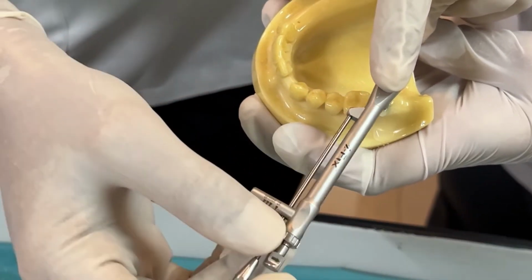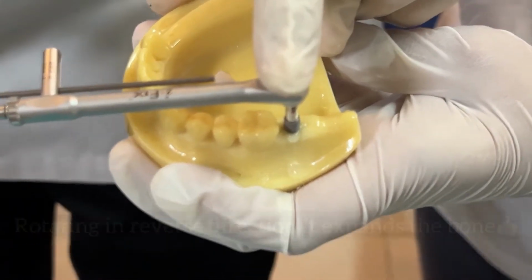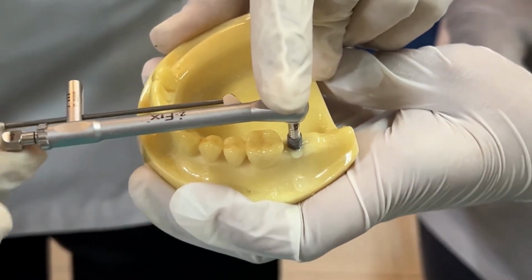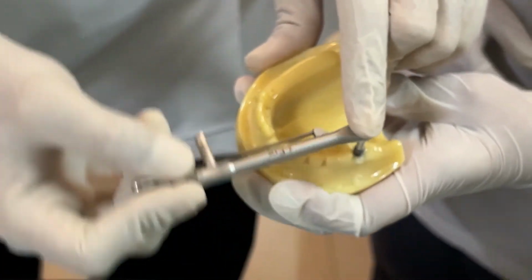So by rotating it in the reverse direction once or twice, I am expanding the bone, right? And then now I have turned it back towards me, and now I am rotating it again. So can you see? My implant is going inside.